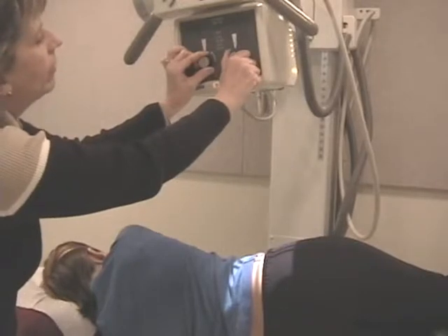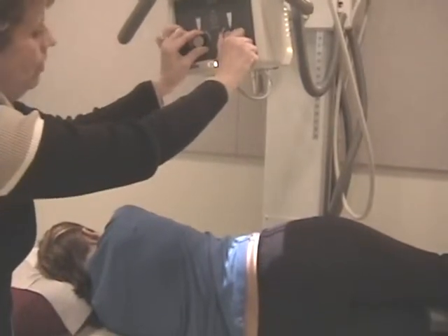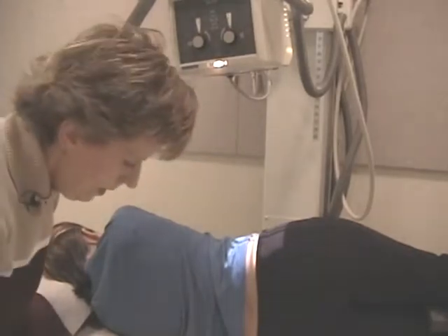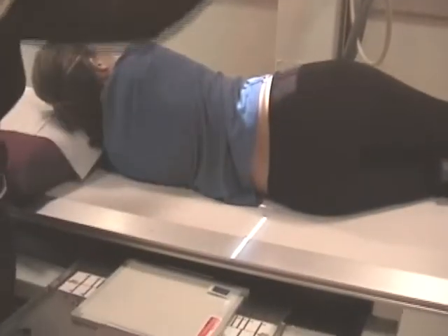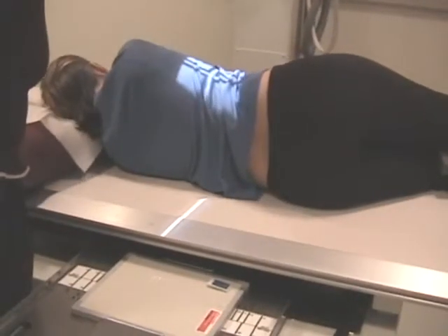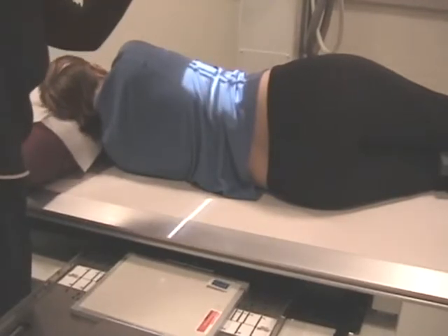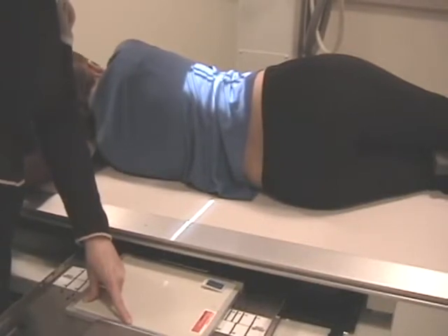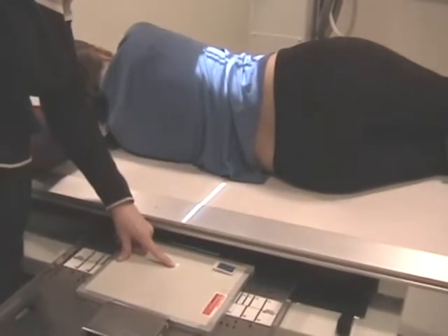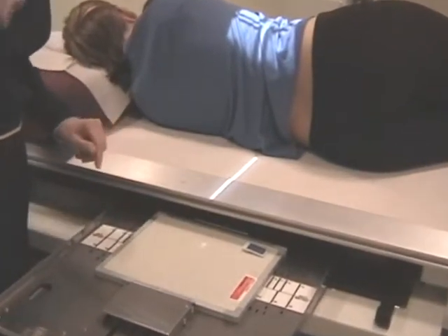There's 8 by 10, and then I'm going to come in a little ways. Okay. And we need to line our film up with our bucky tray again. If you look down at the film, I'm matching up the centering light with the center of the film. Can you see that? Shall I lower the light a little bit? We okay? Lower the light? Okay. Our centering light to the center of the film.